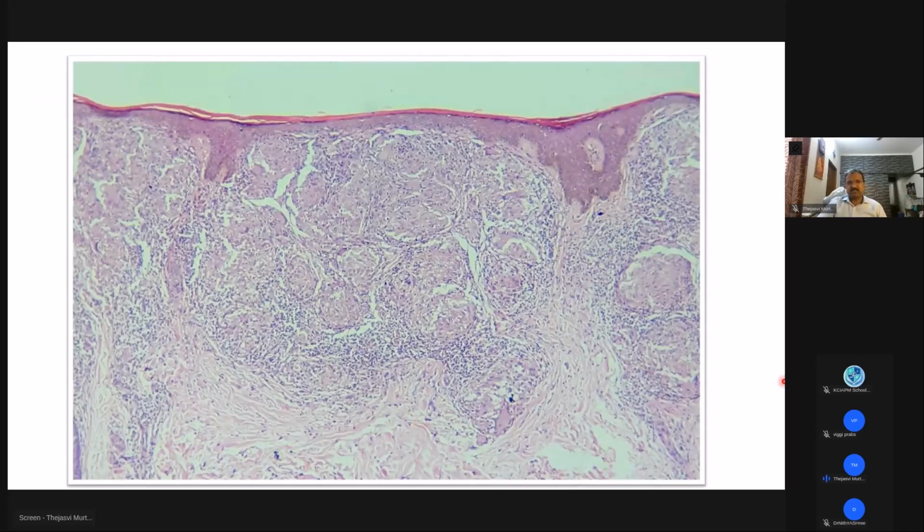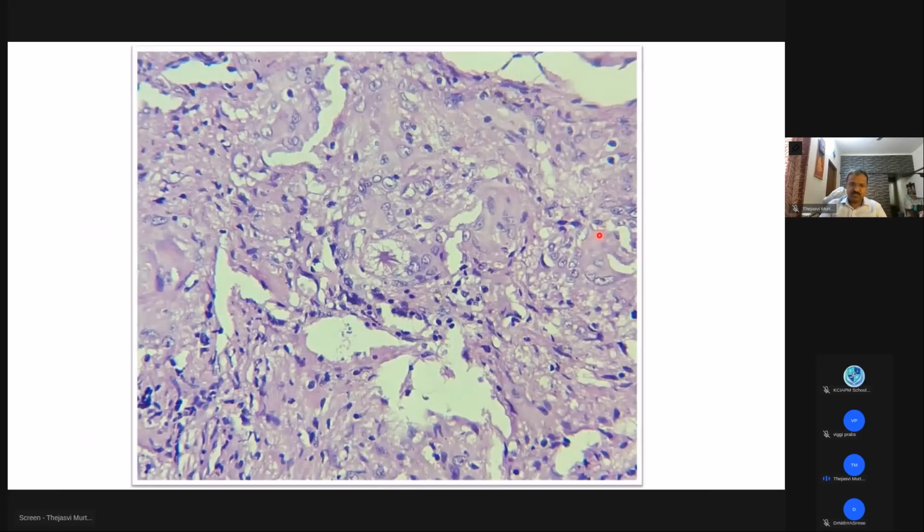And what kind of granulomas are you seeing here? Here you are seeing confluent granulomas, closely packed granulomas with very minimal lymphocytes. This is basically sarcoidosis. Superficial granulomas close to each other with minimal lymphocytes or complete absence of lymphocytes. It is a sarcoidal granuloma. Of course, you're seeing an asteroid body here, in a sarcoid granuloma.